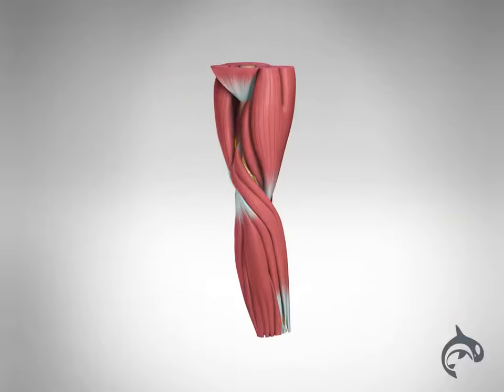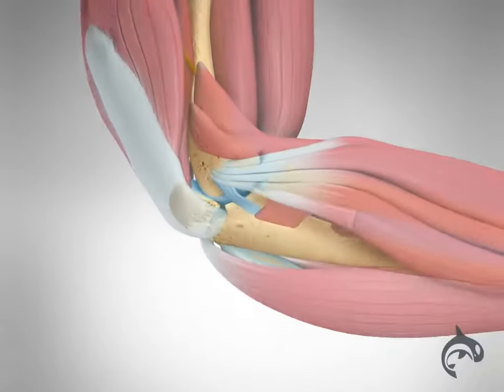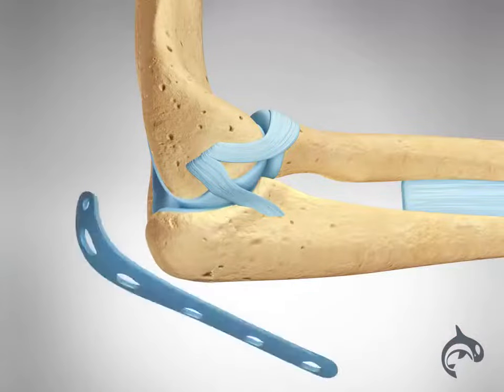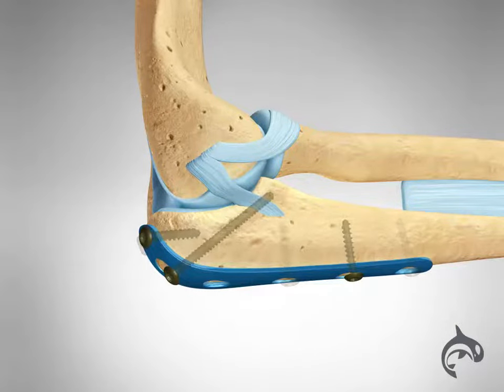When surgery is required to treat the fracture, bone fragments are first repositioned or reduced into their normal alignment. The pieces of bone are then held in place with screws, wires, pins, or metal plates attached to the outside of the bone.